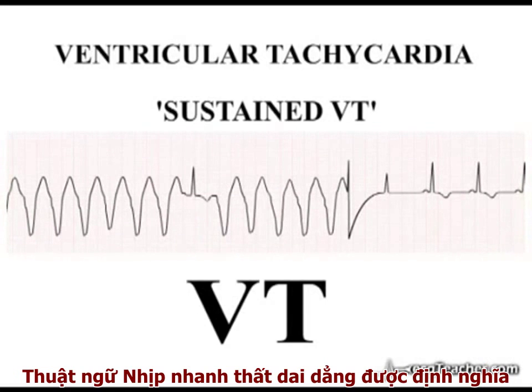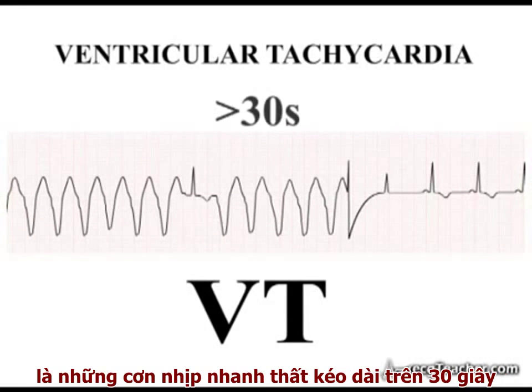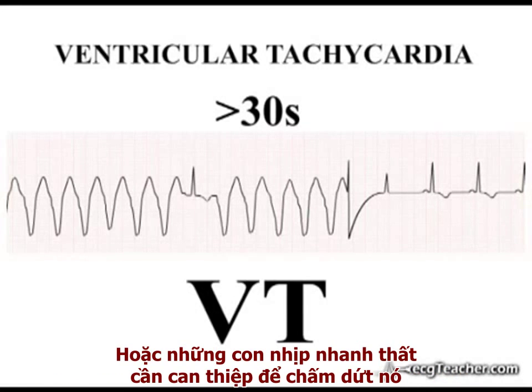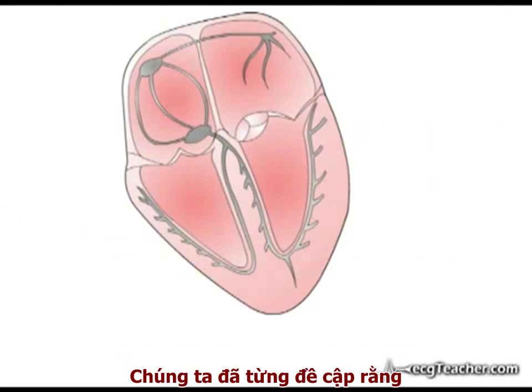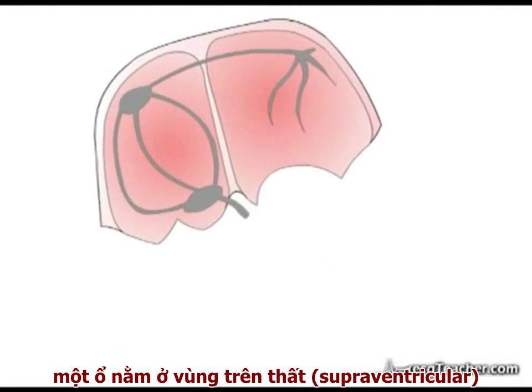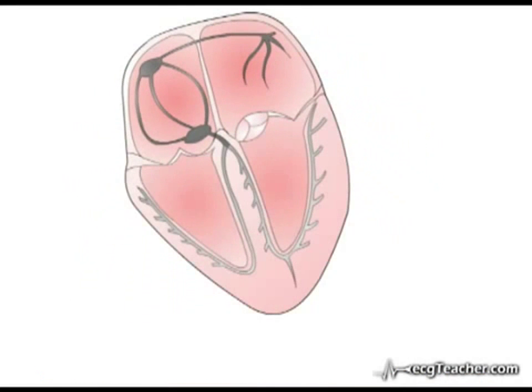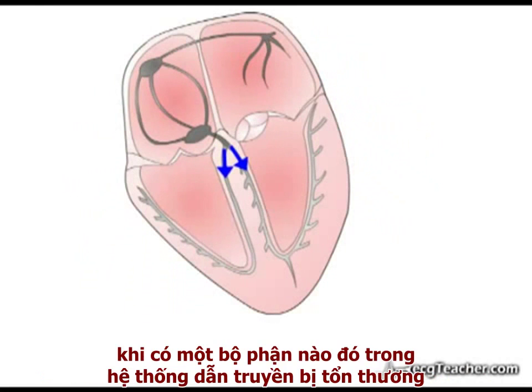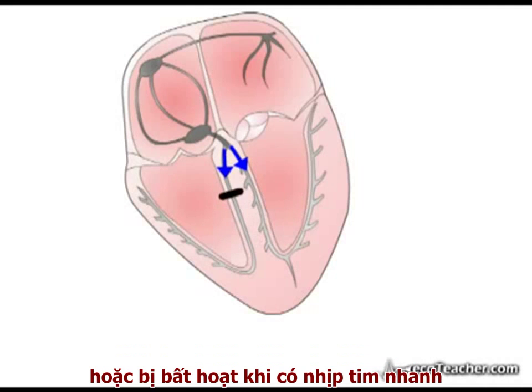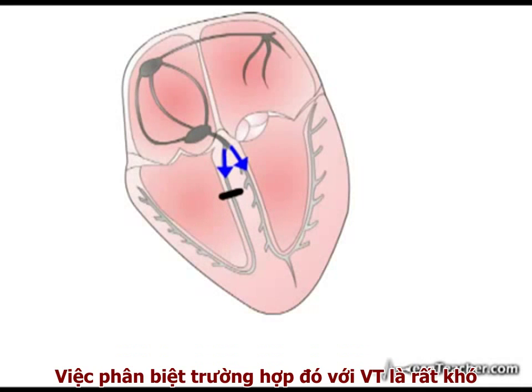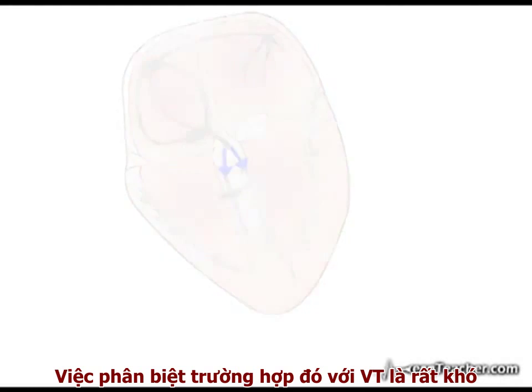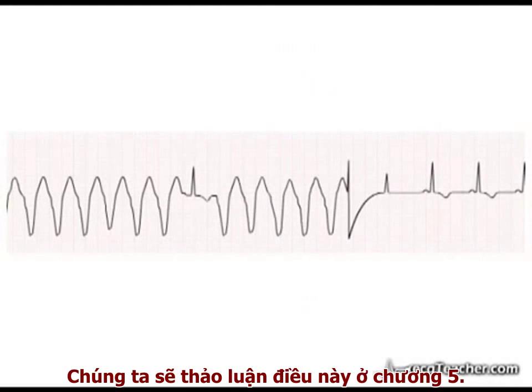The term sustained ventricular tachycardia applies to an episode of VT greater than 30 seconds in duration, or as in our case, an episode requiring clinical intervention for termination. We have already mentioned that it is possible for a focus situated in the supraventricular region to generate a broad complex tachycardia. This situation arises if a component of the ventricular conducting system is damaged or fails to function at higher heart rates. Distinguishing such a broad complex tachycardia from VT is a major challenge, which we will discuss in section 5.